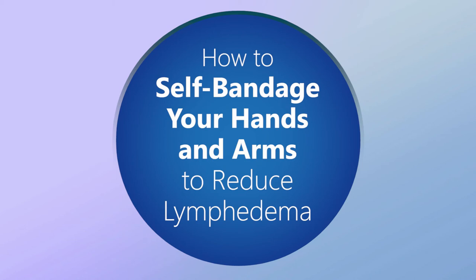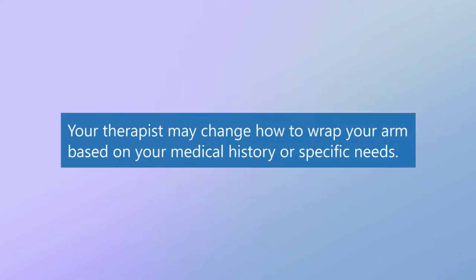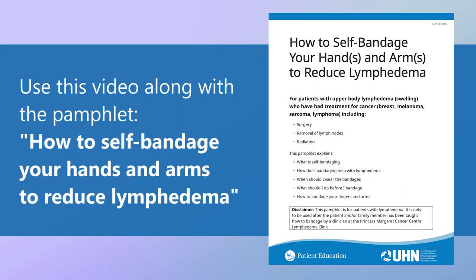How to self-bandage your hands and arms to reduce lymphedema. This video is meant to be watched after you have been taught self-bandaging from a therapist at the Princess Margaret Cancer Rehabilitation and Survivorship Clinic. Your therapist may change how to wrap your arm based on your medical history or specific needs. Use this video along with the pamphlet 'How to Self-Bandage Your Hands and Arms to Reduce Lymphedema.'